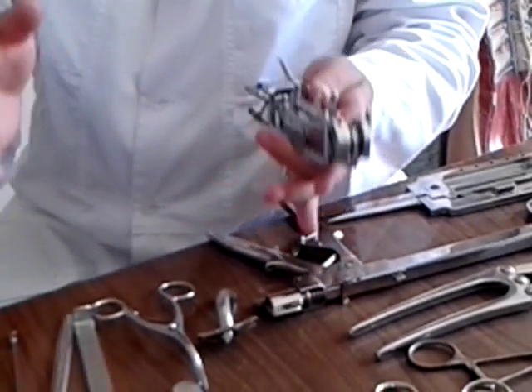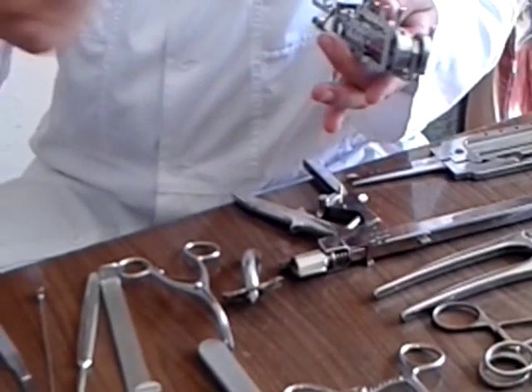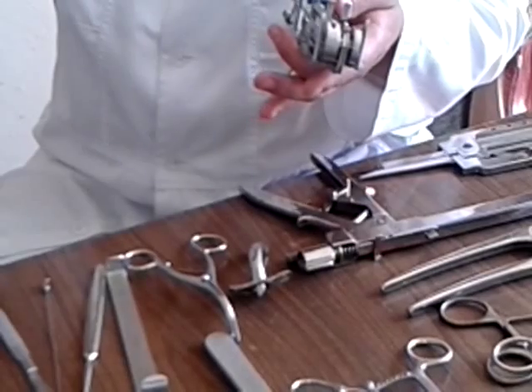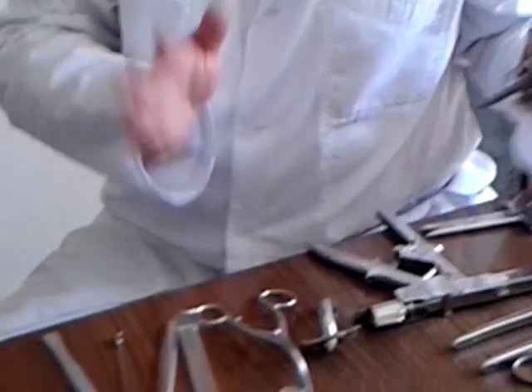This is mechanical suture, without threads, not by hand, but by a special instrument.